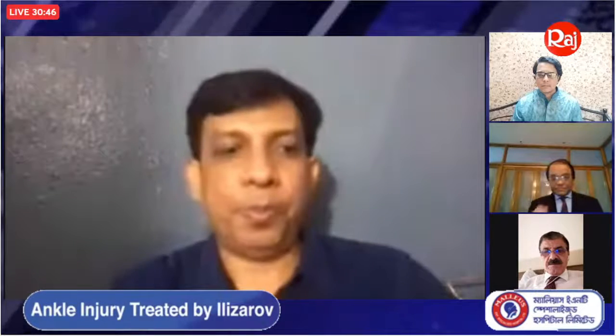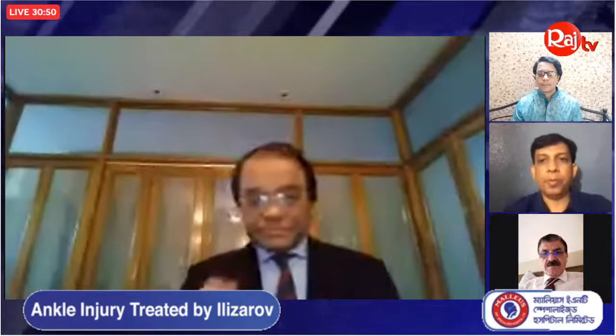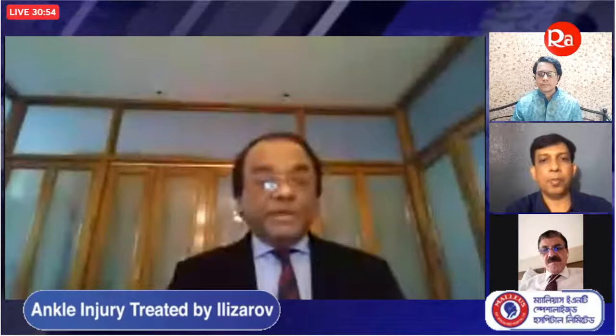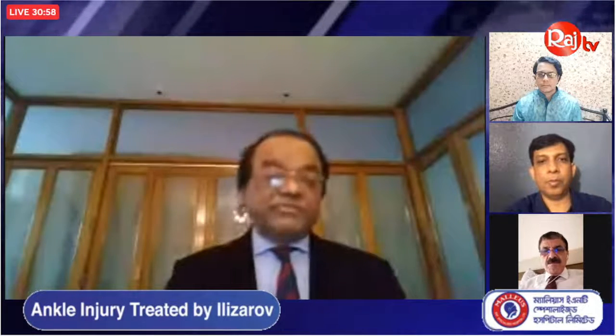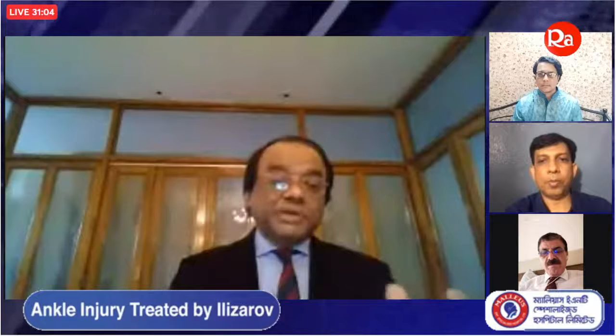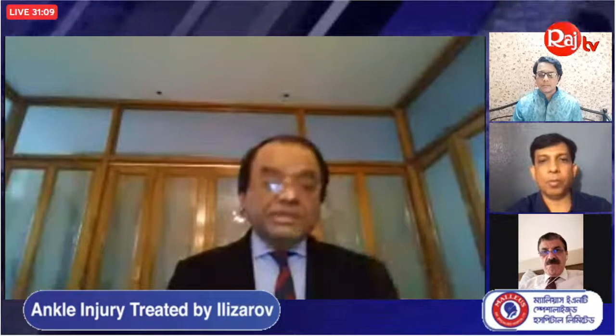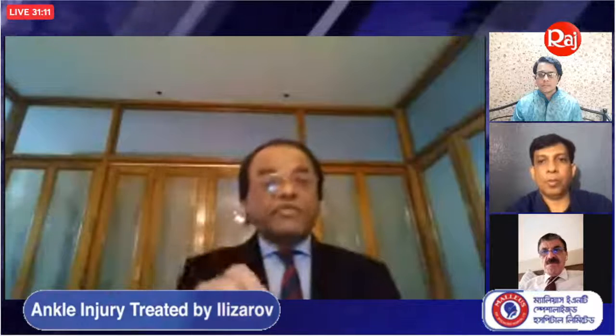Good question. Number one, when you cannot reduce by olive or by closed method, then sometimes you need to go for a minimally invasive approach. In Ilizarov surgery, the beauty is that you can reduce partially, and if you think it needs open reduction, you can go for open reduction through a minimally invasive incision.